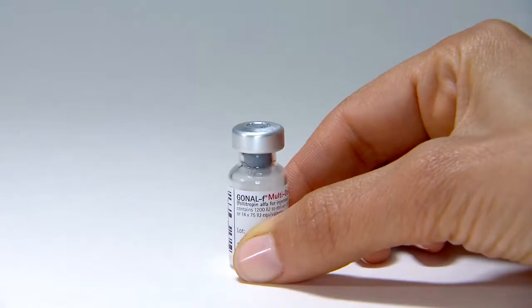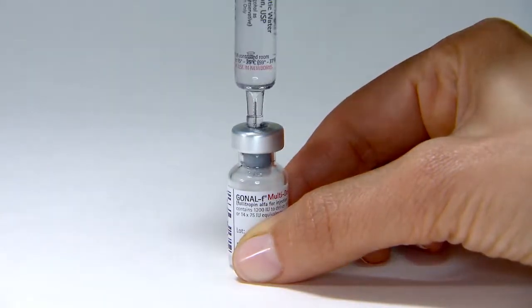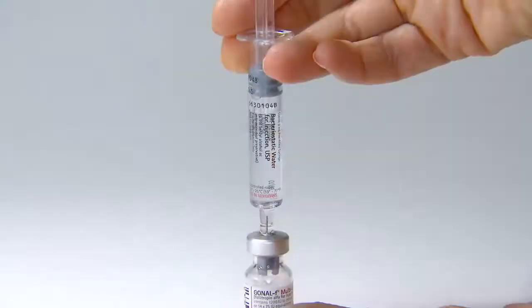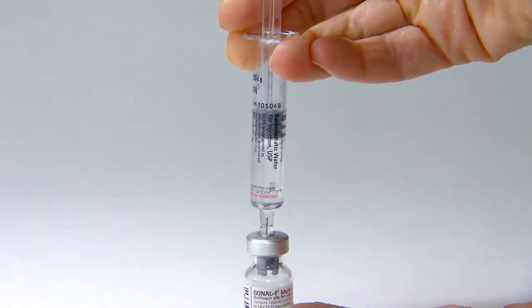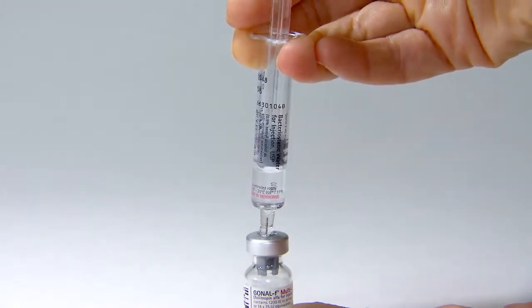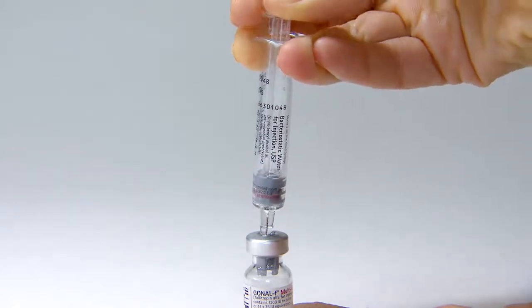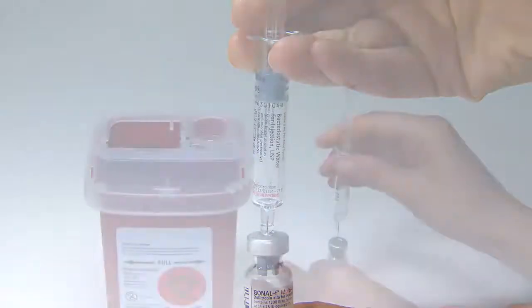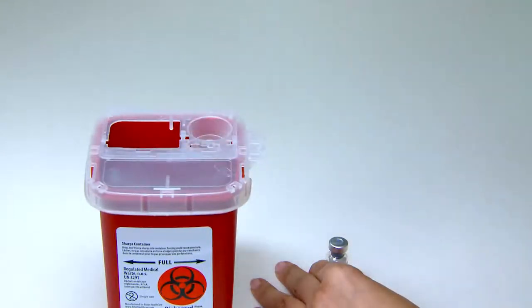With the vial of Gonal-F powder on a flat surface, insert the needle of the pre-filled syringe straight down through the marked center circle of the rubber stopper. Slowly inject the water into the vial by pushing down on the plunger. After all the water has been injected into the vial, remove your finger from the plunger, allowing the plunger to rise to its original position. Withdraw the needle safely. Dispose of the syringe in the sharps container.